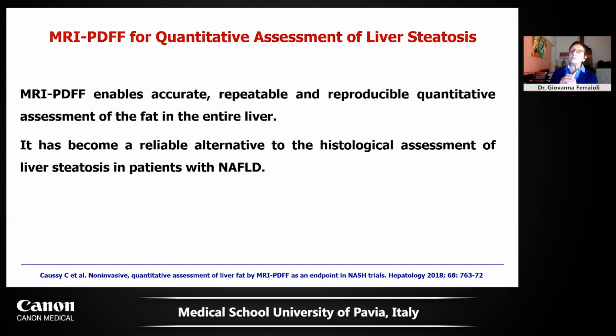And proton density fat fraction obtained with magnetic resonance is a very useful tool for the assessment and the quantitative assessment of fat in the entire liver. And it has become a reliable alternative to the histological assessment of liver steatosis.